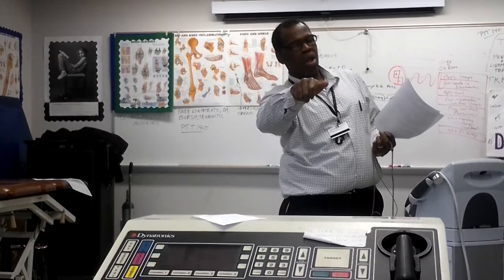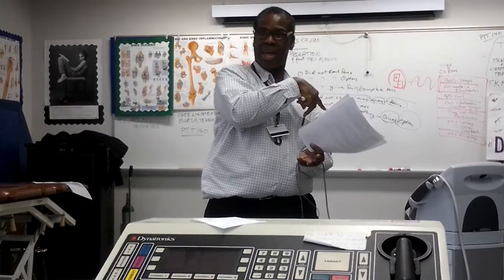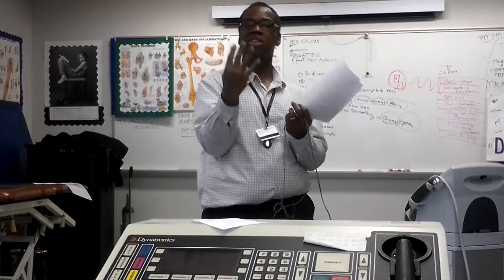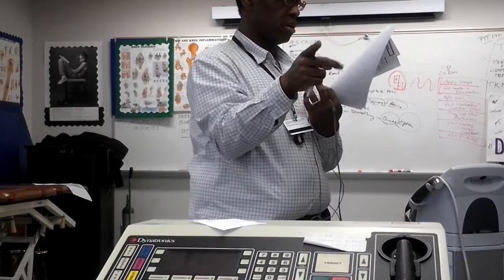A little bit too much where? It's a little bit too much on the right. Well, how's the left? Not that bad. So then I can go to the intensity balance, and I can turn down one side versus the other, still have the same intensity for the opposite side. So the balance balances out how much the person is going to get from that one jack. I can give more to one side and less to the other. So that's the balance or the percentage.